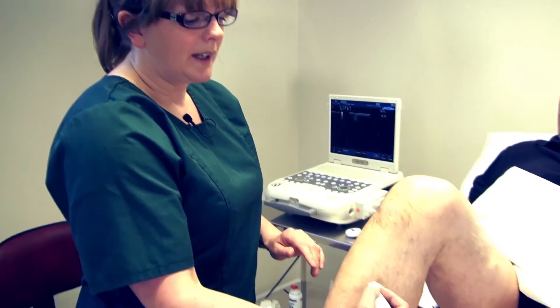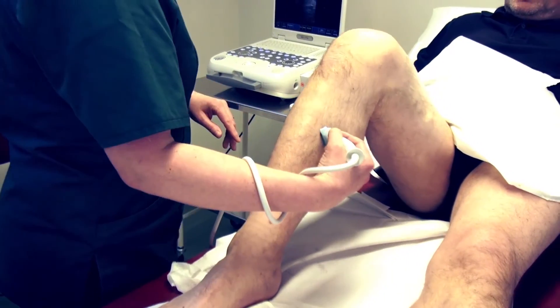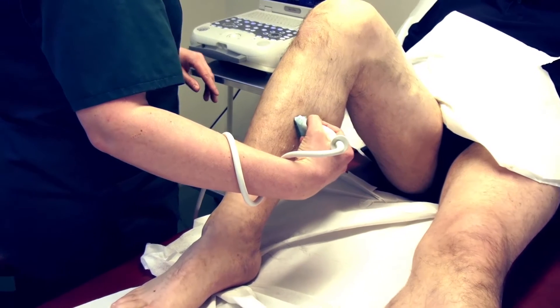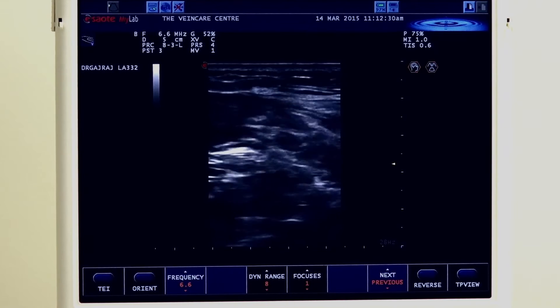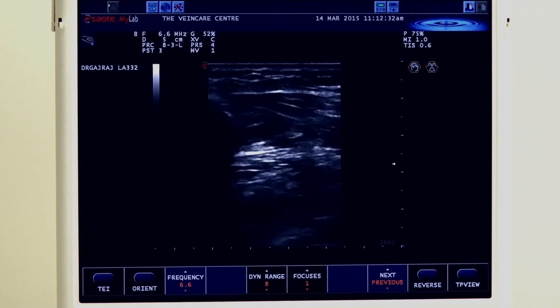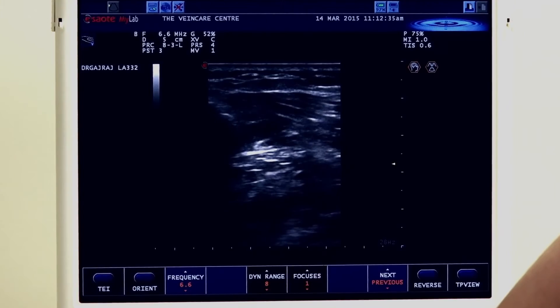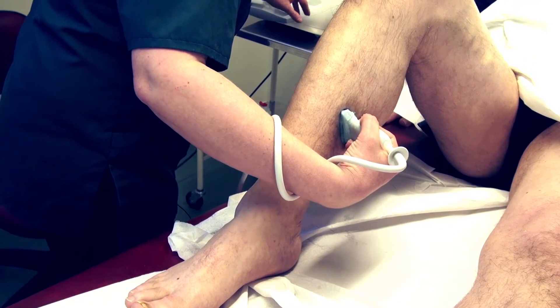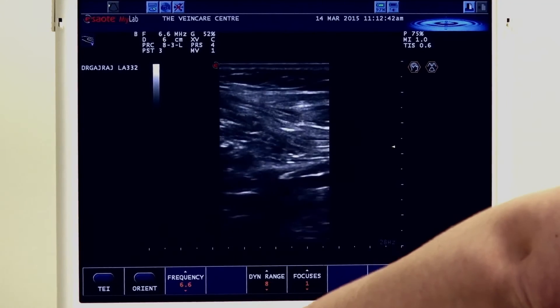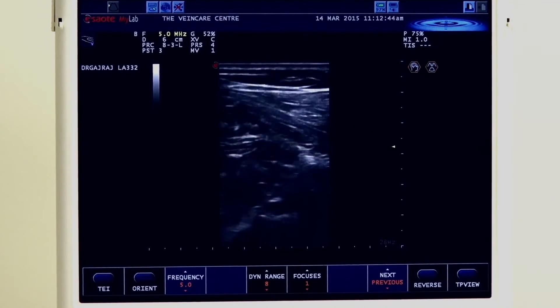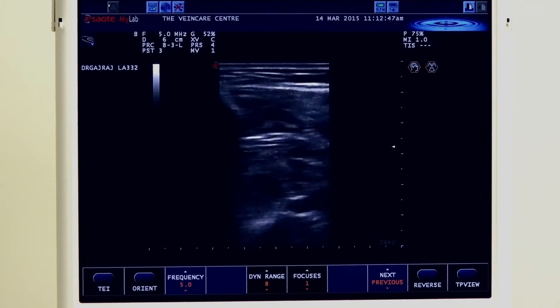Above-knee DVTs are obviously the most significant and we really need to exclude those. If you feel confident enough, we can have a look at the calf veins as well. What we look for is the posterior tibial and the peroneal veins. To pick those up, get your tibia in view on screen and look for the posterior tibial and peroneal veins that lie in the fascial plane. We just need a little bit more depth and reduce our frequency to give a bit more penetration to identify the calf veins.